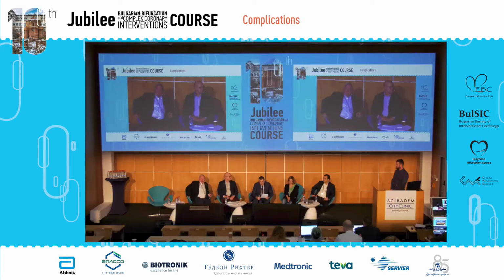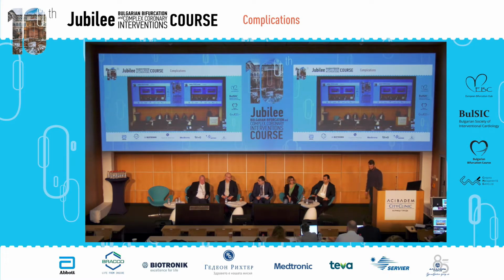The second point, I have to say that I would have treated all these lesions in completely opposite order. Of course, stenting the main vessel, proximal to distal, and limiting my overlapping to unintentional TAP, as we saw yesterday night. So, of course, there are several ways to do that. So your result is excellent. So now we wait. You have to wait for the angiographic result, which is scheduled. In France, we are not allowed, so we don't do it. Okay, so thank you so much, and we will move to your next case.